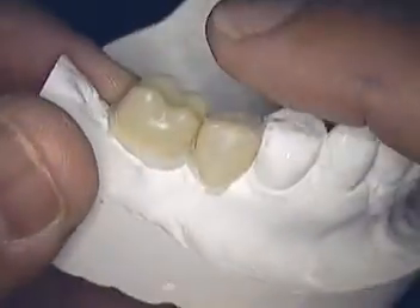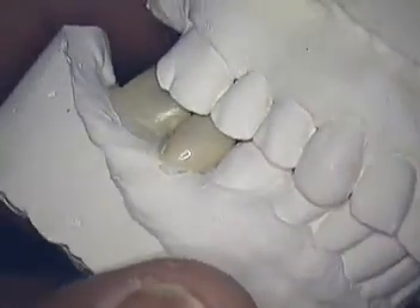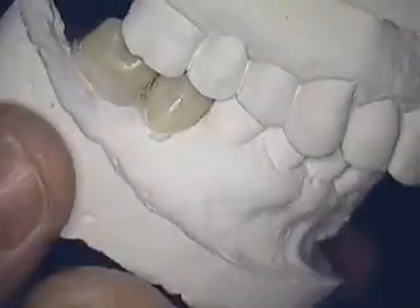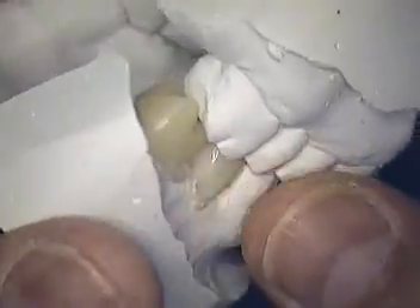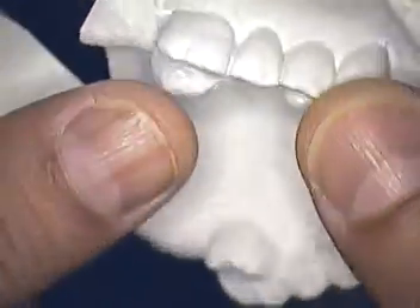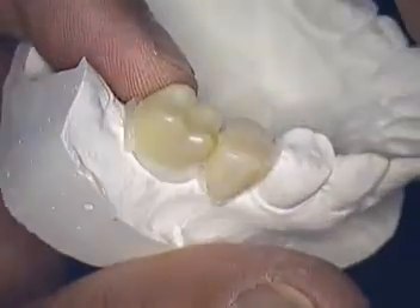We're at the point where you want to look at your wax up. We selected two ion crowns, placed a little white wax underneath, finished the model, and went ahead and made sure that we were close to the occlusion that we wanted. I probably still have to drop the occlusion down a little bit more on the molar. Due to finances, she does not want to have this upper bridge replaced, so it's basically an edentulous area on the lower right.